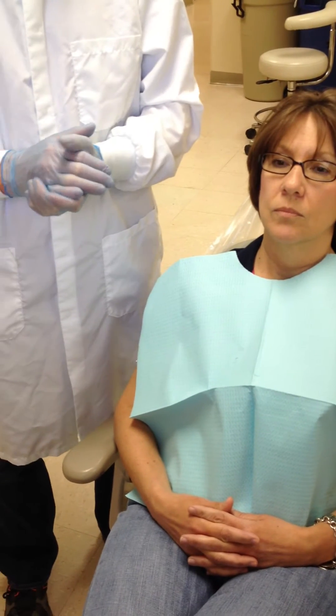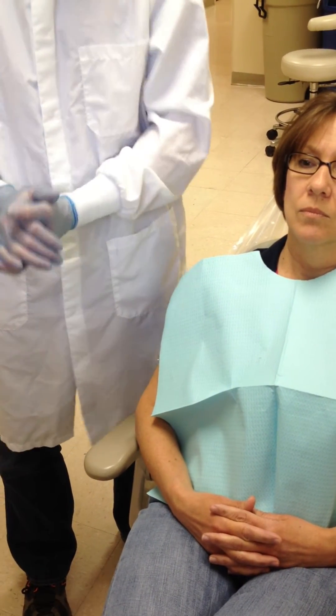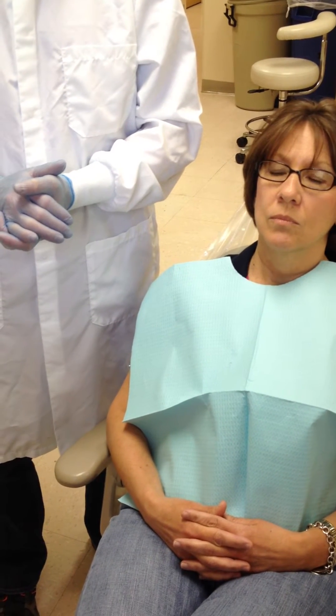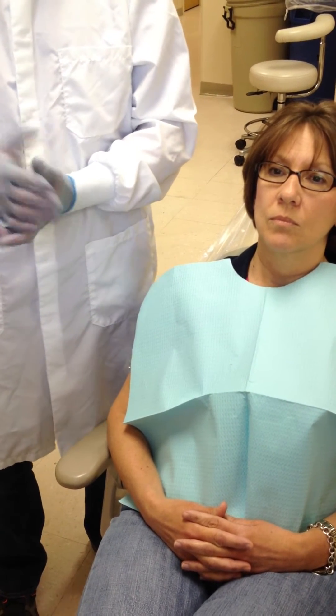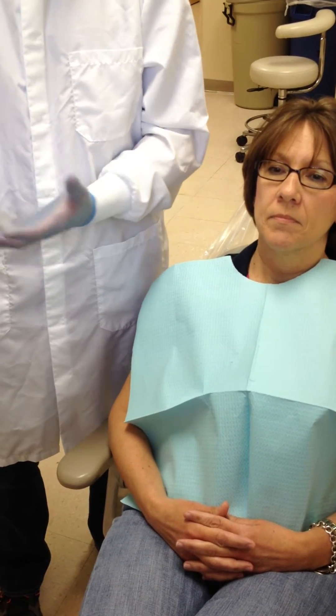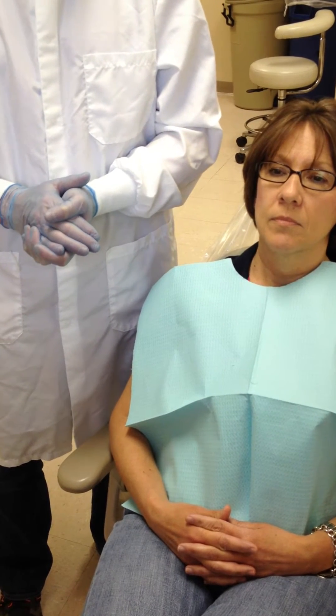We are now going to take a lower alginate impression, a mandibular alginate impression on our patient. We're going to be doing this from the 11 o'clock position, with the patient seated at about the level of my elbows, which is normally our working height. When we sit down and work on patients and recline them, they are at the level of our lap or elbows. So we're going to work at the same position when we take alginate impressions.